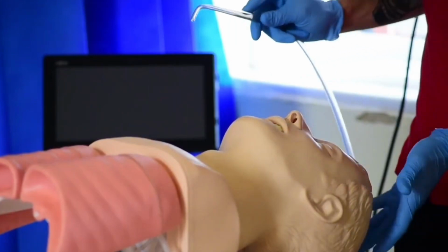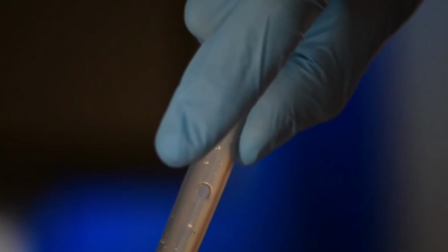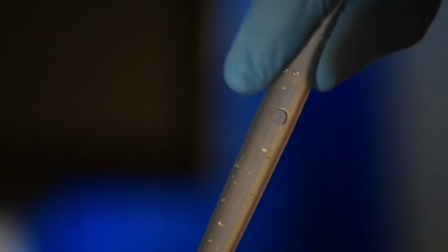The full force of the suction equipment is activated by occluding the circular opening on the Yankauer catheter. Suction should be applied for the minimum time required to clear the obstruction. If the obstruction cannot be relieved by suctioning, or solid, semi-solid, or foreign object obstruction is suspected at a level below the tongue, ensure expert help is summoned urgently.